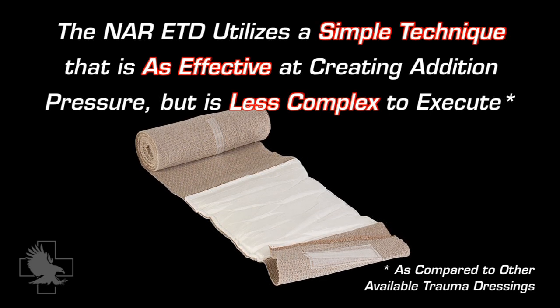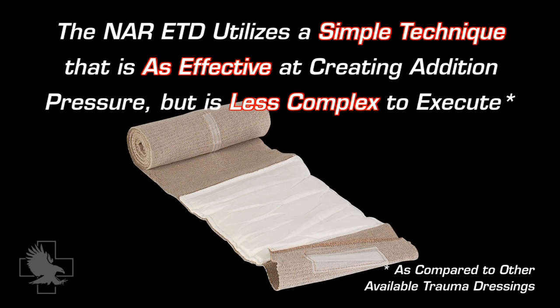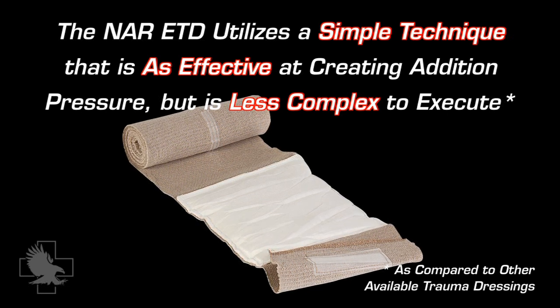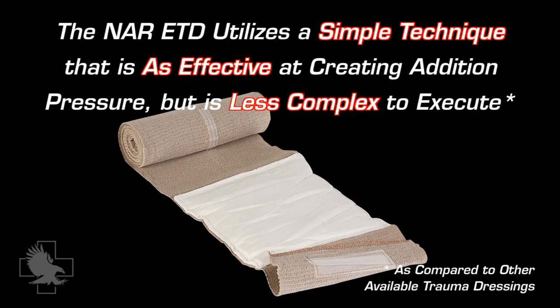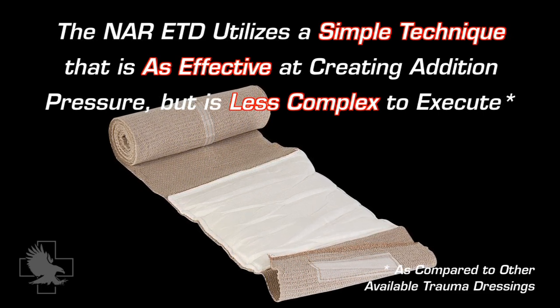Easy open tear notches allow simple access to the bandage. In this video, we will show you a simple technique that is as effective at creating additional pressure, but less complex to execute when compared to other available trauma dressings. We believe this makes it a better procedure when experiencing the stress and urgency of a combat situation.